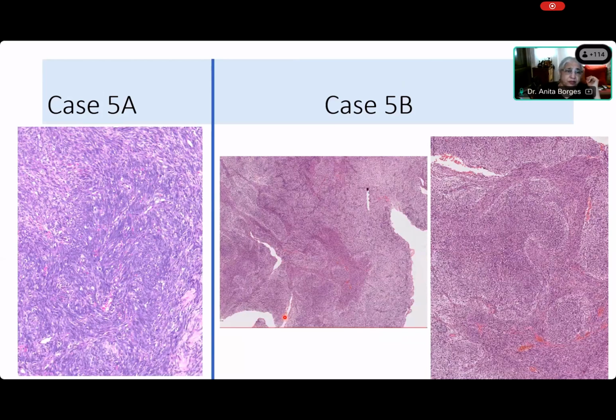No, in a herringbone pattern, if you think this is a herringbone pattern where you see a spine there, okay, that's not a spine. In a herringbone pattern, the two ribs meet. They actually have to meet. Let me see if I can. Right. If you think that this is a herringbone pattern, that here is the spine, and I'm seeing some things like this, no, you're not seeing it.